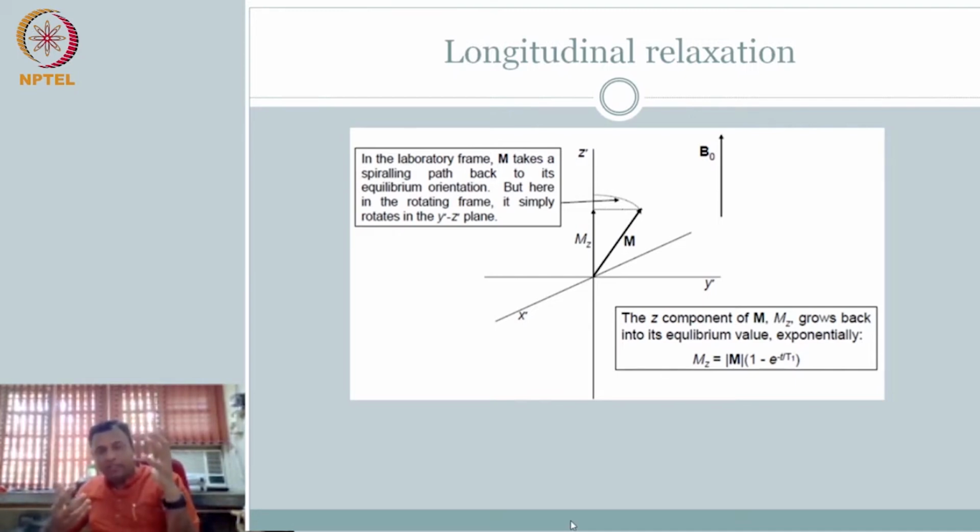But how do we measure this at each location? That is going to be the challenge that we are going to talk about. So in order to do that, we already understand that we need to have flexibility in pushing this down, recording, how fast we push, how many times we push. All these are parameters that are under your control. You have the ability to turn the excitation pulse on, turn the excitation pulse off. How long do you want it on? How frequently you want it on is all in your control.